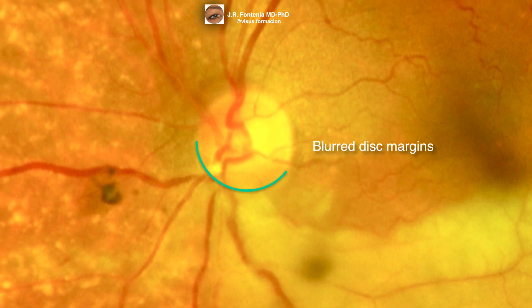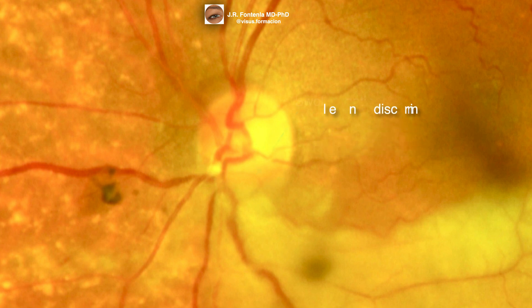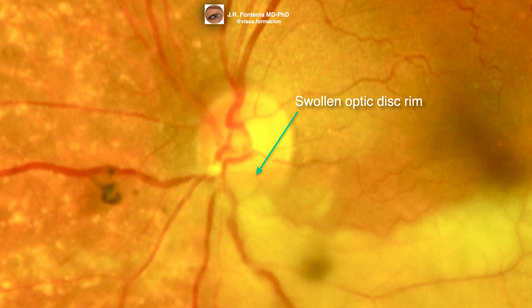When the edema affects the optic disc or the most immediate peripapillary area, a blurring of the optic disc margins will appear, as well as edema of the fibers that constitute the optic disc neuroretinal rim.